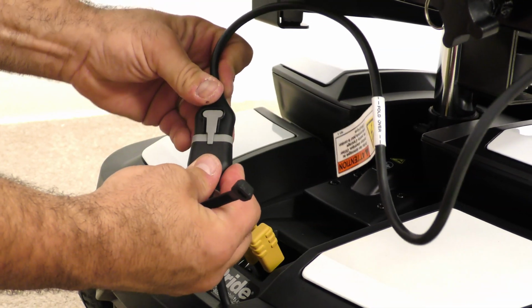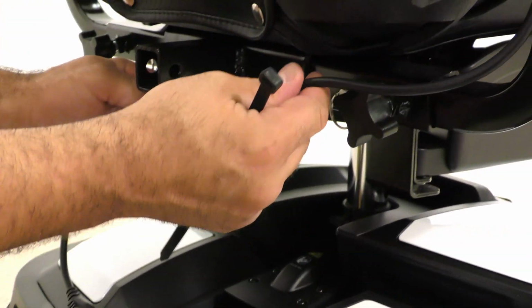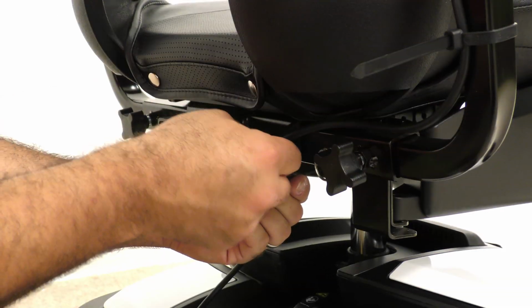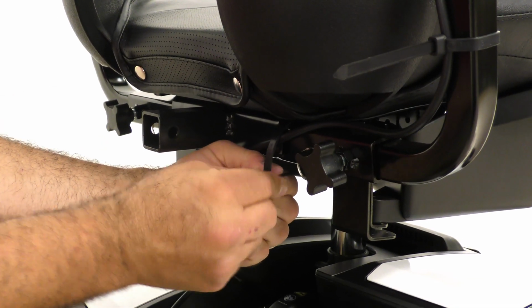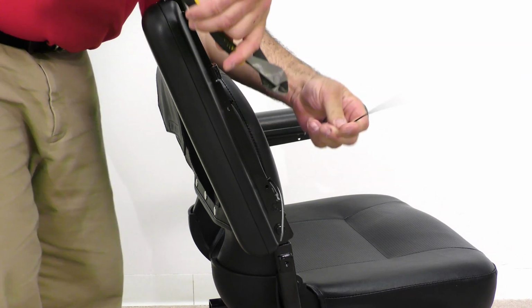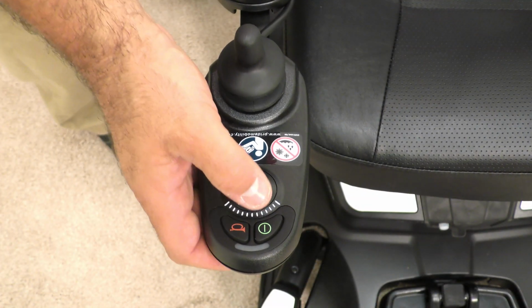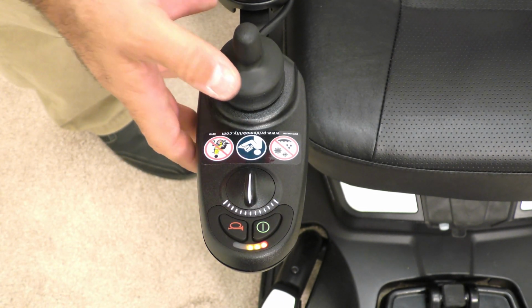Connect the joystick to the power module harness. Always orient the armrest upwards to ensure that there will be enough slack in the harness, and finish securing the harness to the armrest. Cut the excess wire ties flush so that there is no chance of the consumer getting scratched. Turn the unit on and test it to make sure it works properly.